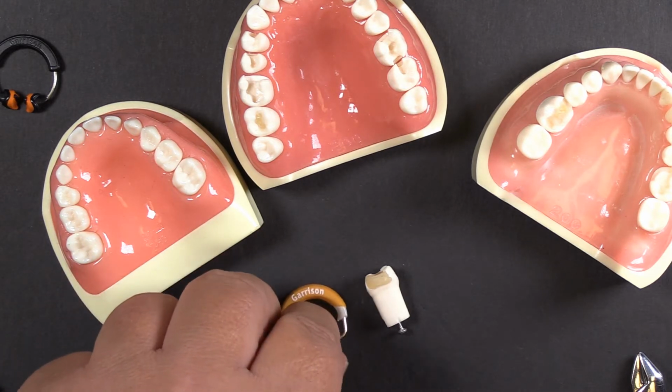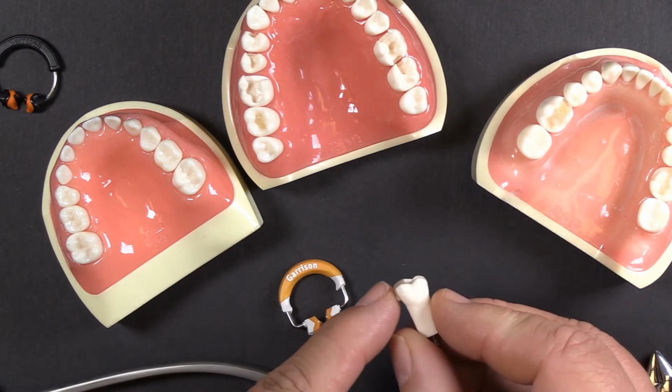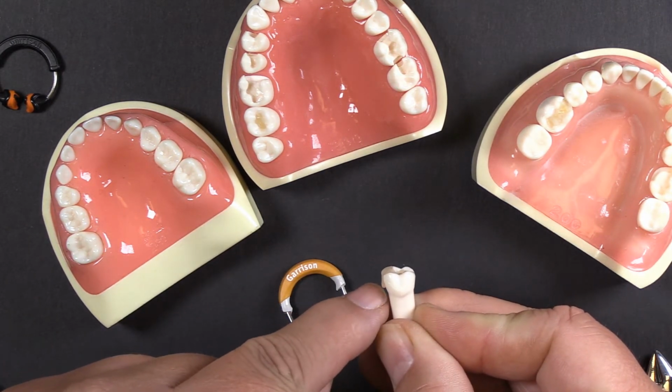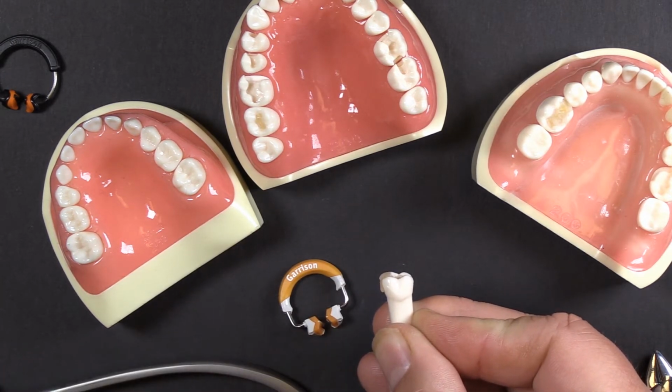The rings of the sectional matrix system, all of the sectional matrix systems out there, are very strong spring clips, and they drive in interproximally to provide separating force. So when you couple that with a very aggressive wedge, you can get a great deal of separation. And then if you burnish the band like you might have been used to doing with a Tofflemire band, where you have to really stretch that metal out, if you burnish aggressively like that, you end up stretching that metal over the top of that oversized wedge, and you create that overhang on the gingiva.